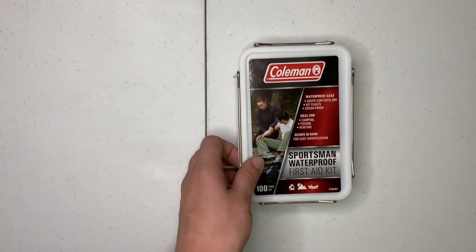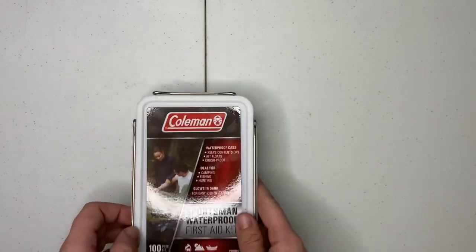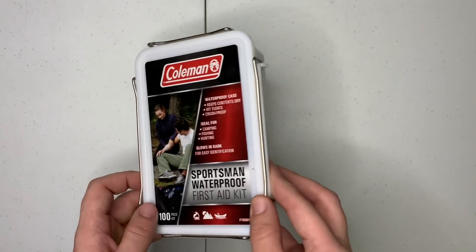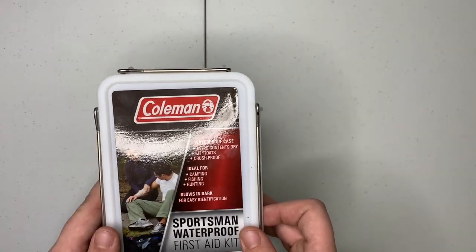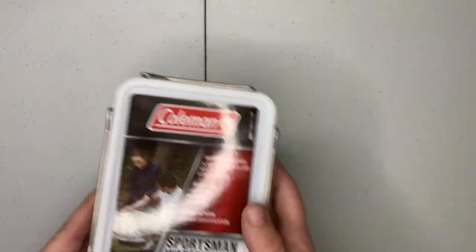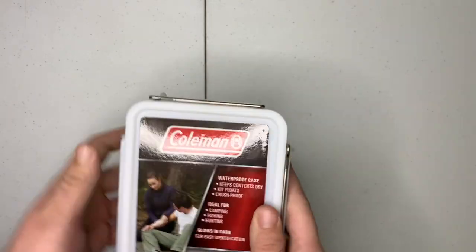Welcome to RBO. Today we're going to be taking a look at the Coleman First Aid Kit. It's in a little watertight container, which is pretty dope. It's ideal for camping, fishing, and hunting. Glows in the dark, so I guess this container glows in the dark. It's a 100-piece kit, and again it's from Coleman, so let's check her out.